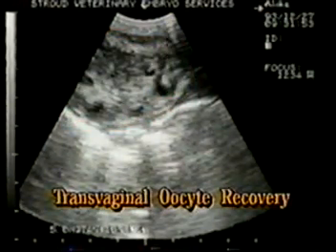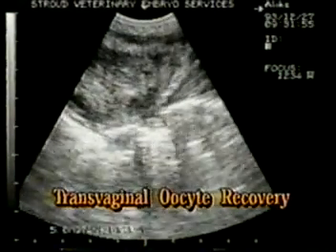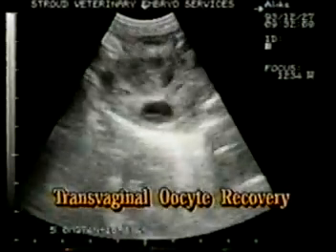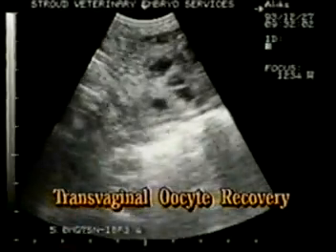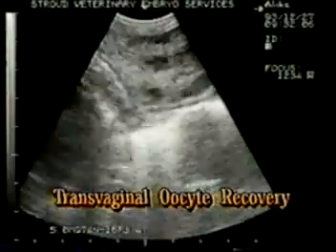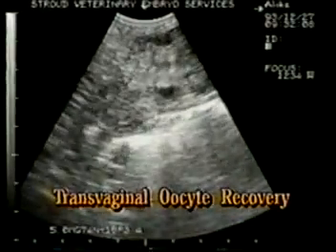Suction is employed when the needle is inserted into the follicle to remove the follicle contents. The ovary is manipulated so that the follicle comes into alignment with the needle. The needle is then pushed in and out to correspond to the depth of the follicle in question. As soon as the needle penetrates a follicle, its contents are aspirated immediately.